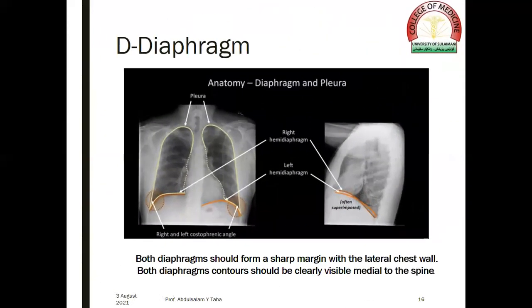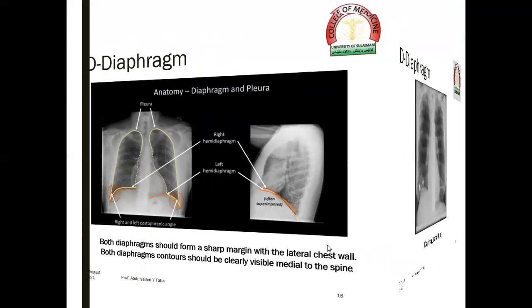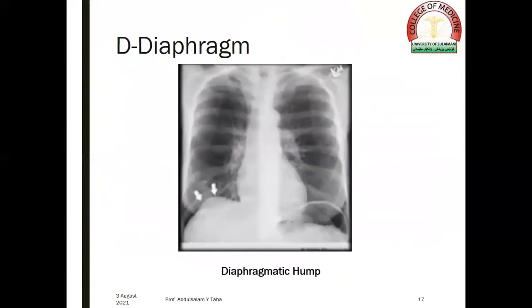D stands for the diaphragm. Both diaphragms should form a sharp margin with the lateral chest wall, creating the costal phrenic angles. Both diaphragm contours should be clearly visible medial to the spine at the region of the cardiothoracic angle. A normal variant of the diaphragm is a diaphragmatic hump, like in this film.